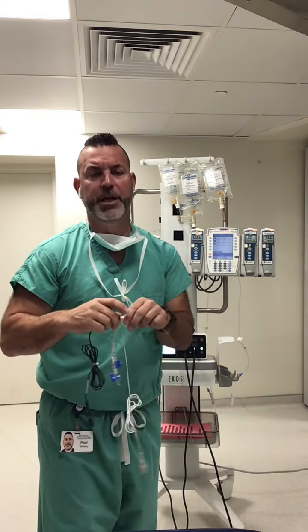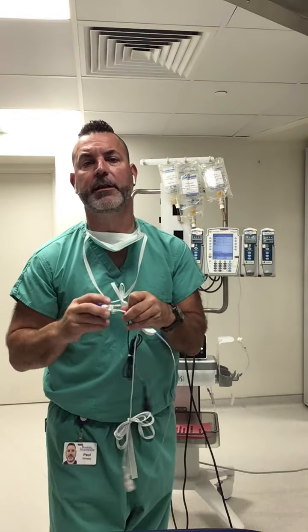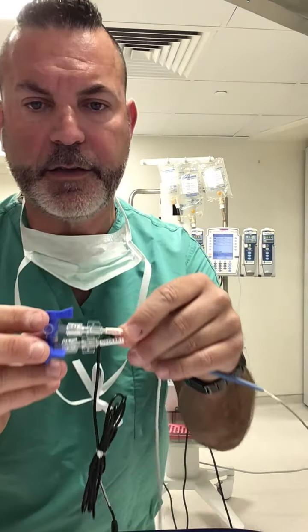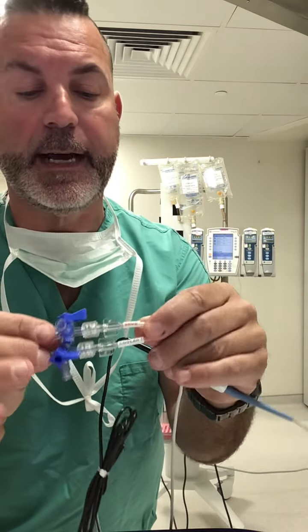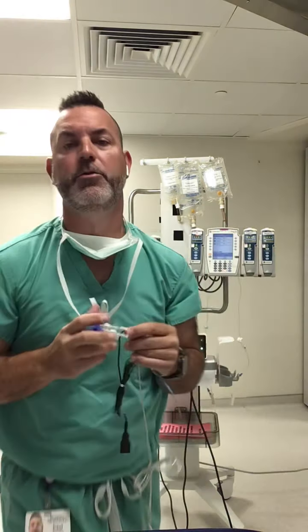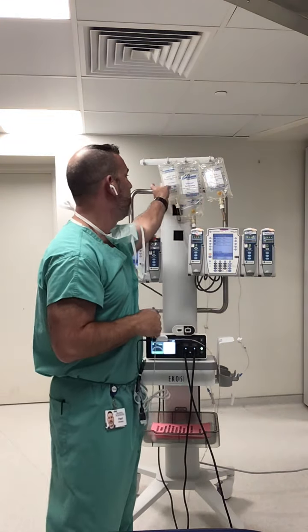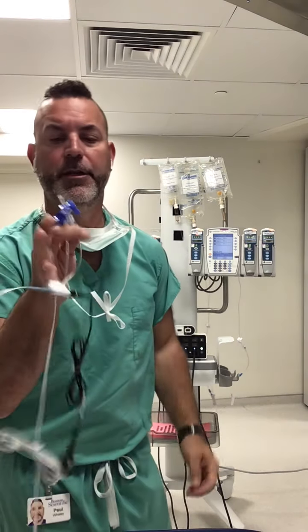First and foremost, you're going to see my EKOS catheter right here. Nurses and techs, you guys are going to be taking a look at these catheters and thinking, gee whiz, I've got 3 fluids, where do they all go? Well, here we go. What's really great about EKOS and Boston Scientific is that they literally put 2 of your 3 fluids in their label on my catheter. Check it out. Red for drug, high-risk medications, and then blue for coolant, because he's the cool guy. That's how I explain it in my in-service as well. We have 3 fluids that are delivered. We have normal saline coolant, he's the blue guy, and then I have a high-risk medication called TPA, that's the red one. So you already know where 2 of your 3 fluids go on your catheter.